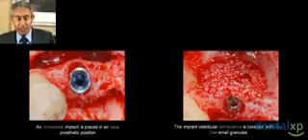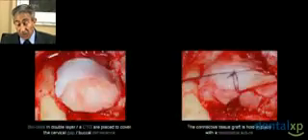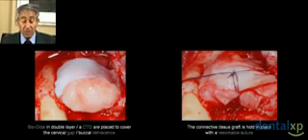So in this case, given to me by Dr. Testori, we have an advanced periodontal disease case. Some implants have been already inserted on the lower jaw, but most of the teeth are going to be extracted on the uppers. So this is the time of the extraction with implant placement with bone graft, guided bone regeneration, and connective tissue graft. So first of all, we do an atraumatic extraction.